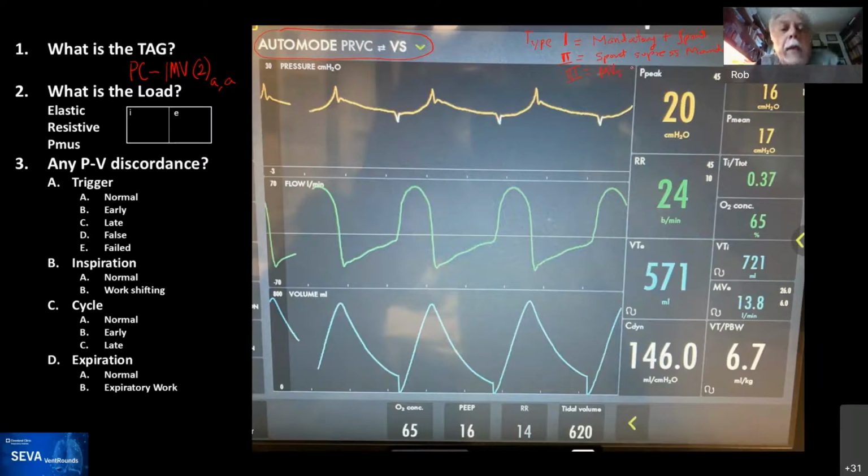So now it's taking account of the tidal volume as well as the spontaneous rate. If the spontaneous minute ventilation is higher than that mandatory minute ventilation, then again, mandatory breaths will be suppressed. And then the fourth kind is dual targeting, where the patient can turn a mandatory breath into a spontaneous breath by taking a large enough inspiratory effort.